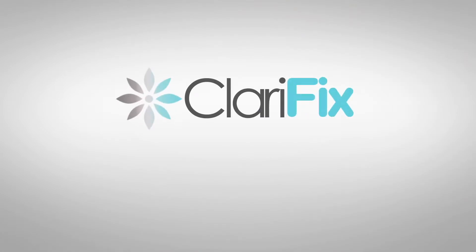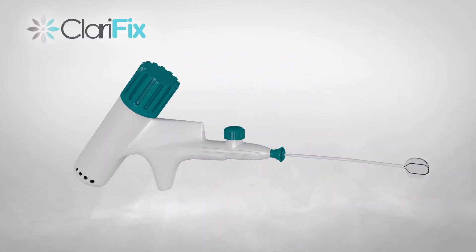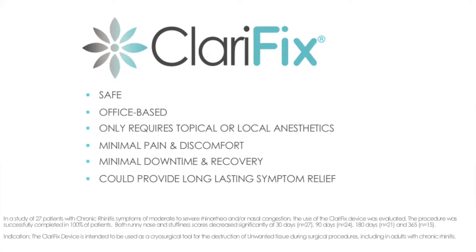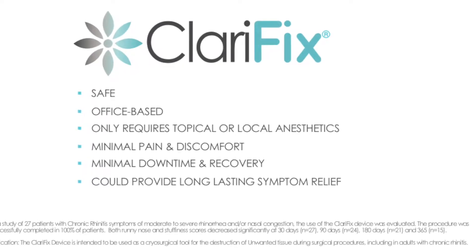Clarifix is an innovative cryotherapy device designed for use by ENTs in patients who suffer from chronic rhinitis. It is a single-use device that offers a safe, office-based procedure that requires only local or topical anesthetics.